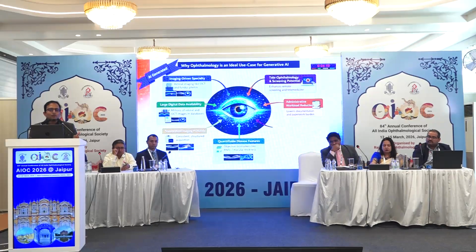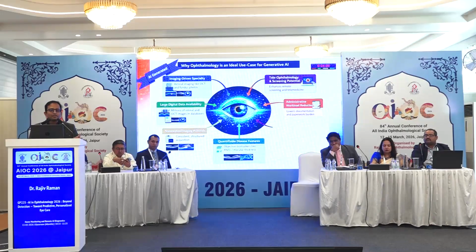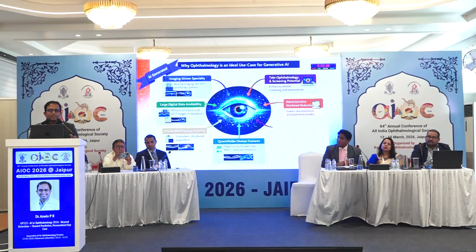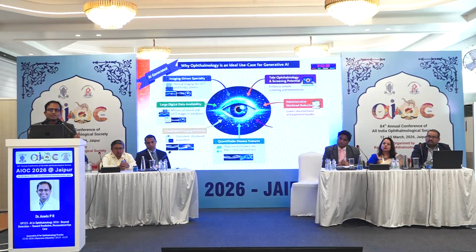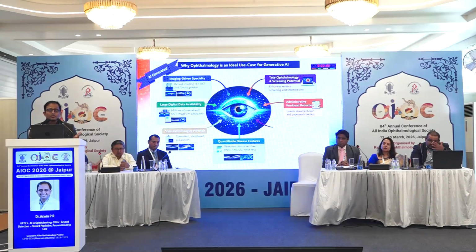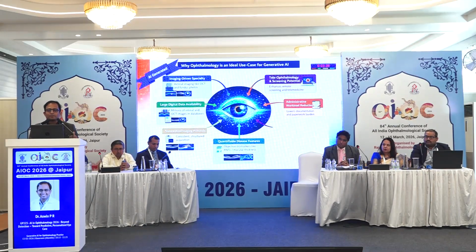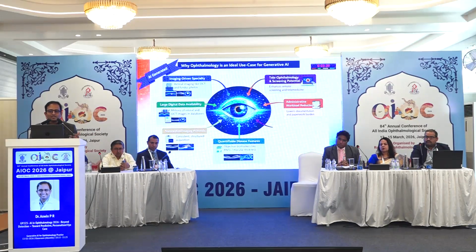And now, why is ophthalmology such an ideal use case for generative AI? Predominantly because it's such an image-driven specialty. There are a lot of retinal photos, OCTs being taken on a daily basis, and there are so many images that can be used to train an AI. And especially because there is standardization across imaging protocols, all this gives you structured data that an AI can learn from and then can be used for practice. There are also quantifiable disease features like RNFL thickness, macular thickness. All these are biomarkers also that can help AI learn and get better. And then there's also scope for teleophthalmology and screening potential, like other speakers have already mentioned before me.